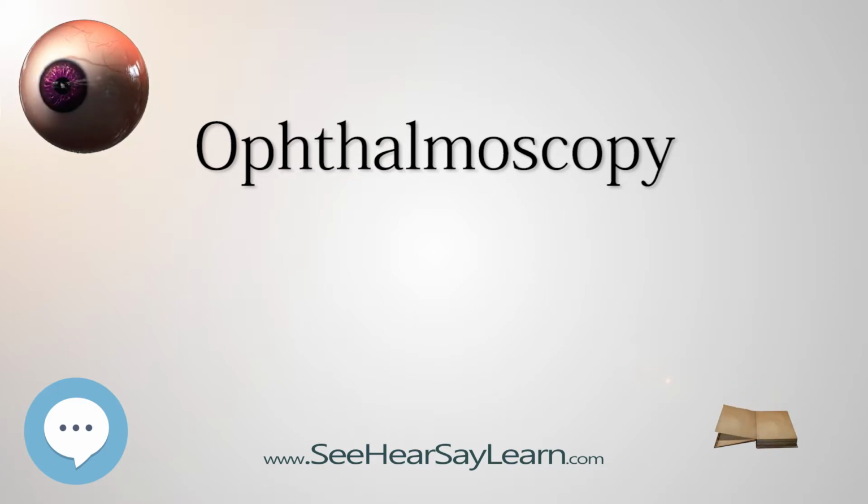Dilation of the pupil. To allow for better inspection through the pupil, which constricts because of light from the ophthalmoscope, it is often desirable to dilate the pupil by application of a mydriatic agent, for instance tropicamide. It is primarily considered ophthalmologist equipment. Recent developments like scanning laser ophthalmoscopy can make good quality images through pupils as small as 2 mm, so dilating pupils is no longer needed with these devices.